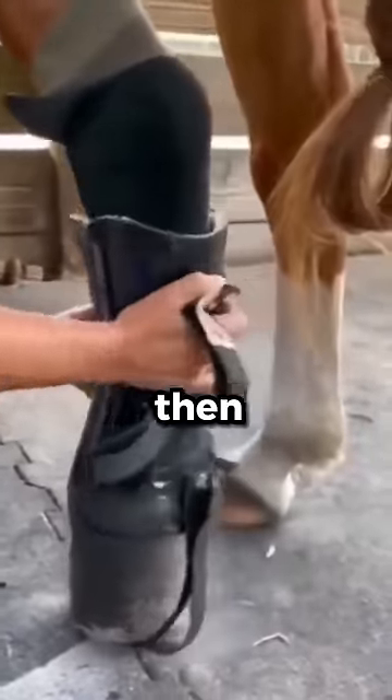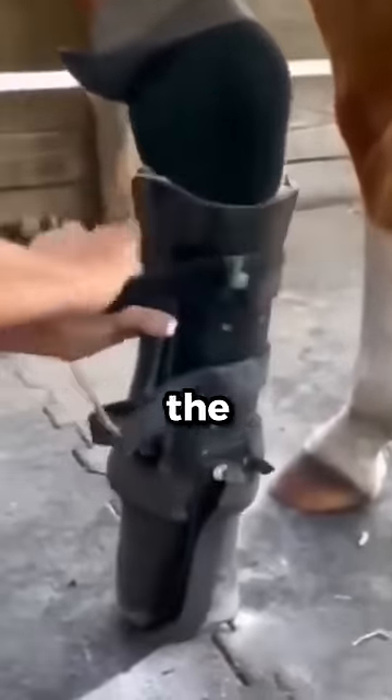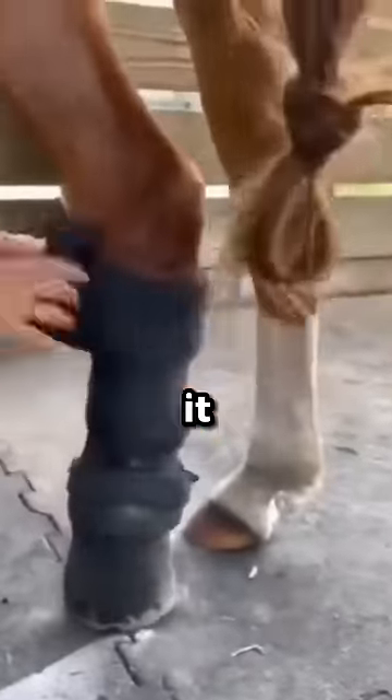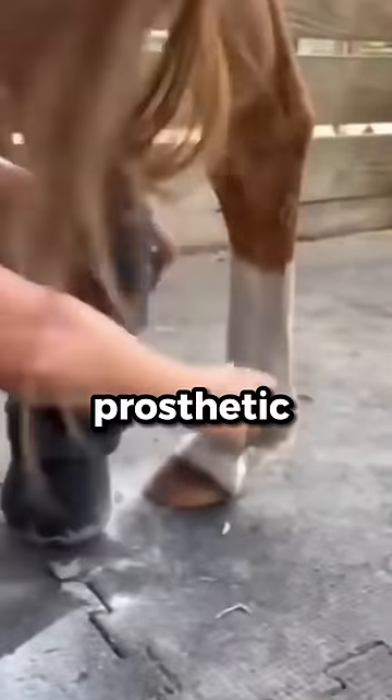Here you can see the owner attaching and then strapping the prosthetic foot to the horse's leg. After that, the owner carefully folds multiple sleeves to keep the leg in place. But to make sure it doesn't fall off whilst the horse runs, the owner also tightens the prosthetic with a Velcro band. Now watch the pure excitement when the horse finds out it can run again.